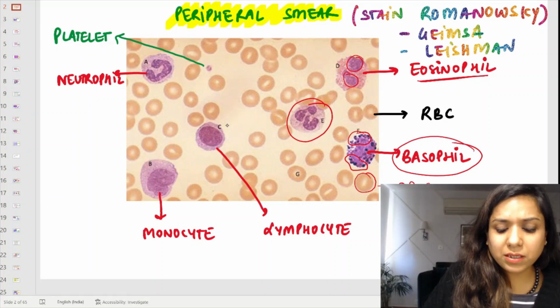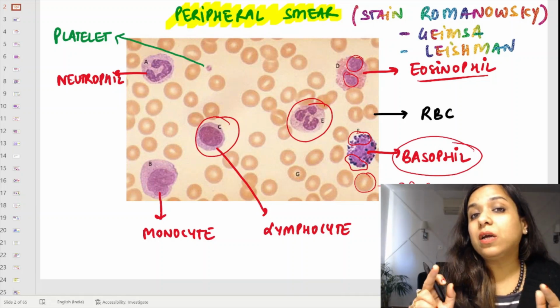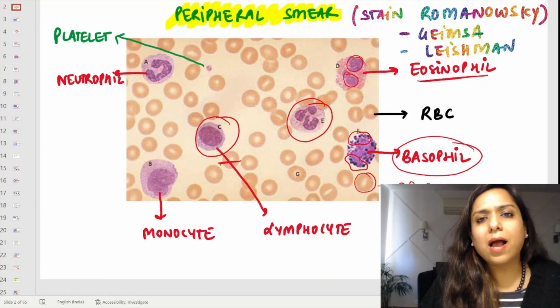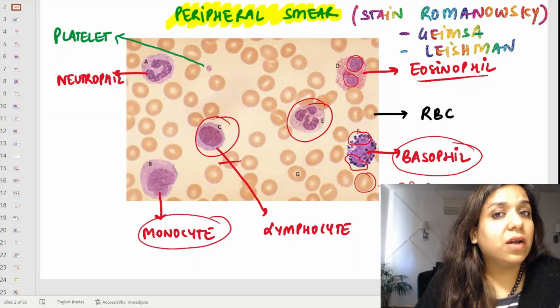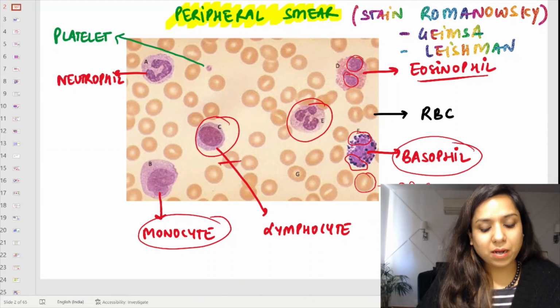granules. This is a normal lymphocyte, which is actually the smallest blood cell, which is a agranulocyte. So there will be no granules in the cytoplasm, as I can see in this image, and it is a very small cell with a round nucleus, right? Monocyte, on the other hand, is also an agranulocyte. There are no granules in the nucleus, right? In the cytoplasm, I'm sorry.